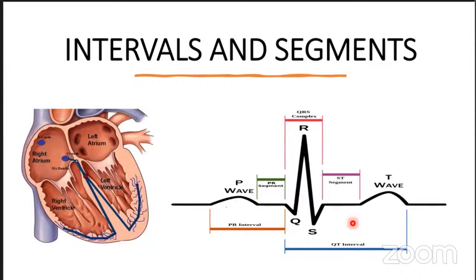And most times, when do you see this? You see it in clients with hypokalemia. So again, I've mentioned 3 very important pieces of information you must know for the NCLEX. Number 1, when I see my PR interval prolonged, I'm suspecting a heart block in my patient. Number 2, if I see the ST segment elevated, I'm suspecting a myocardial infarction.